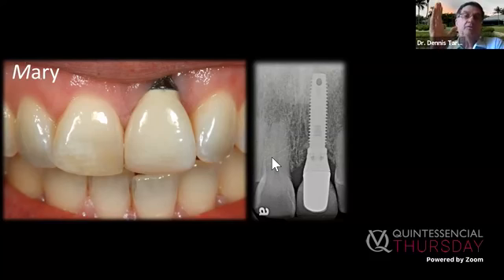The implant was placed too far forward with too big an implant. Arn mentioned that. So this implant's been there. She's been walking around like this for 8 years. And she has a hand in front of her face. And I said, she's a sweet lady. I said, Mary, why do you have the hand in front of your face? Well, she giggled and she said, well, take a look. She had this black thing sticking out.